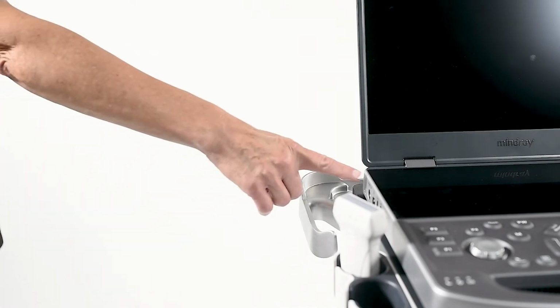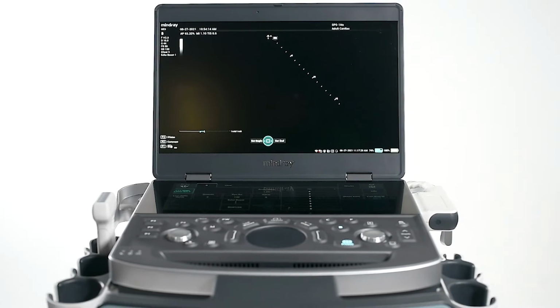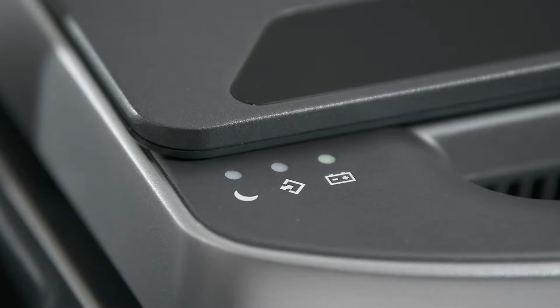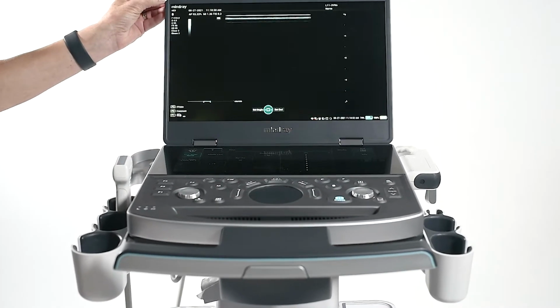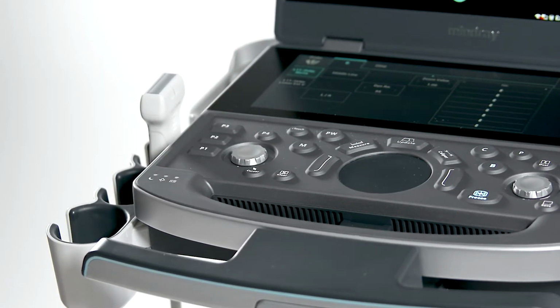The power button is located on the left side of the system. To put the system in standby mode, either close the monitor or press the power button and select standby. If the system is in standby mode, there will be a moon icon flashing on the bottom left of the control panel. To wake from standby, either open the monitor or press the power button again. The system boots in 5 seconds from standby.